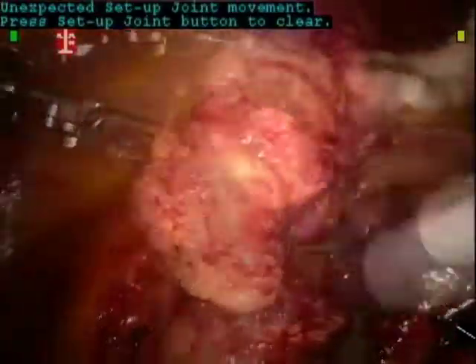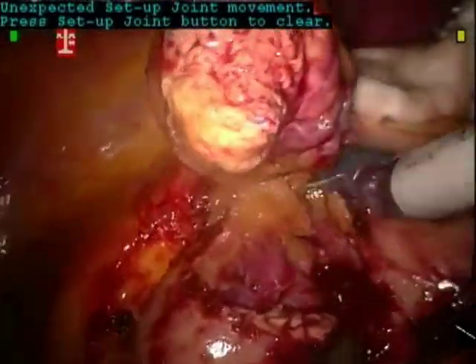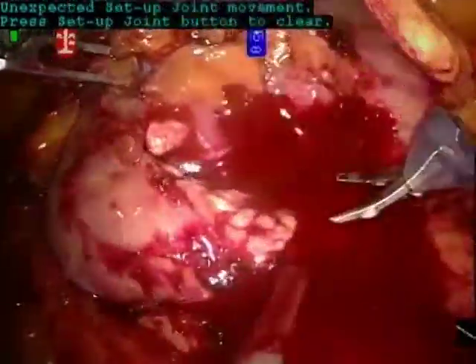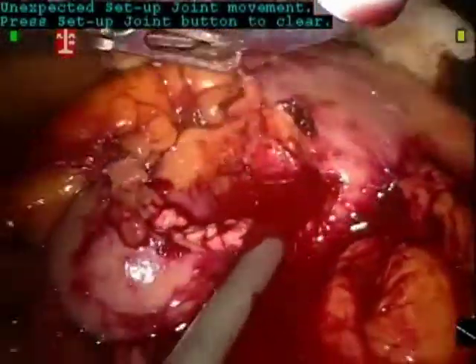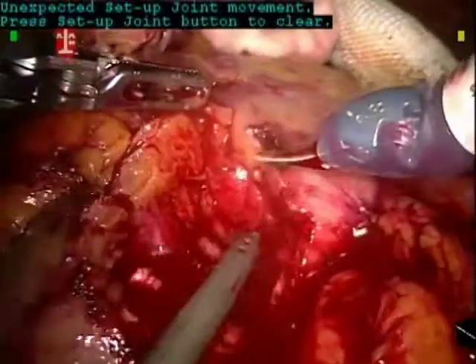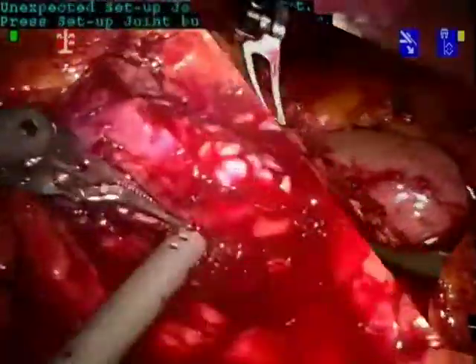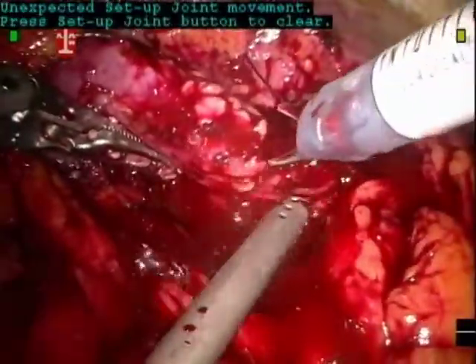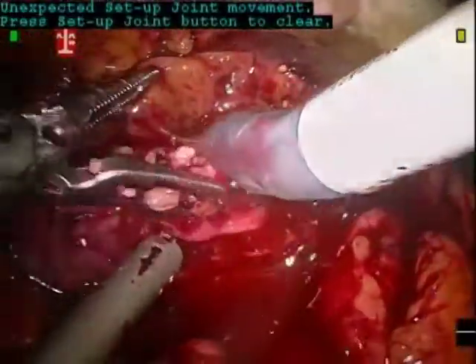It is recognized that we cut into the tumor. The excision is complete, but bleeding is obscuring the field. Prior to re-excision, hemostasis is achieved with a figure-8 suture. Once hemostasis is achieved, re-excision proceeds with excellent exposure.